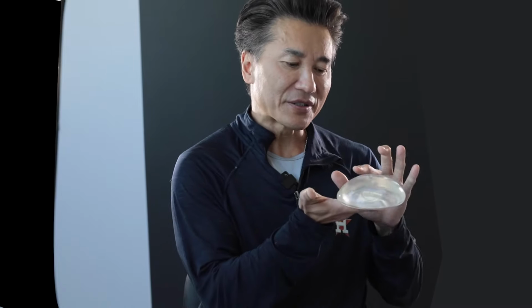Yes, there are. There are certain things that you can do. Using certain implants, for example, there's the soft touch implant, there's the gummy bear implant, which is a type of silicone implant, but it's more cohesive. The only thing with a gummy bear implant is that because there's less rippling, it has to be made a little bit firmer, okay? And when it's firmer, there's less rippling, but when you feel the breast, it doesn't feel as soft. So there are pros and cons to everything, and by examining each patient, we can figure out the best technique possible to try to minimize the chance of rippling.